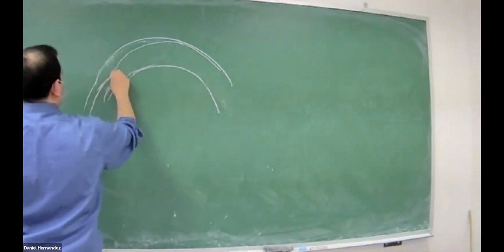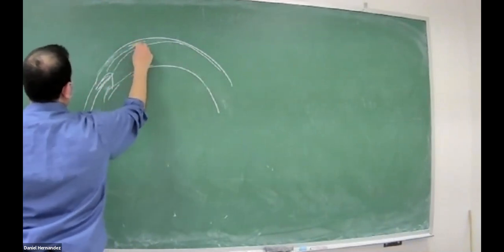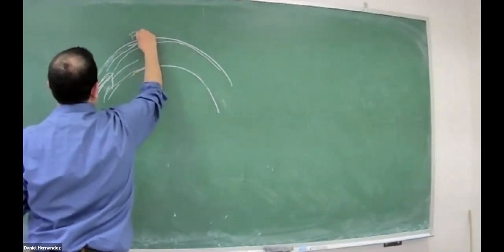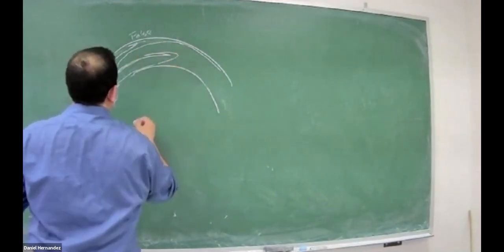We have blood flow going up the arch. We'll have blood entering our lumen, so this will be our false lumen. We'll have blood continuing in the arch in our true lumen.